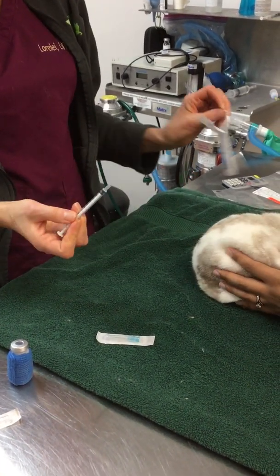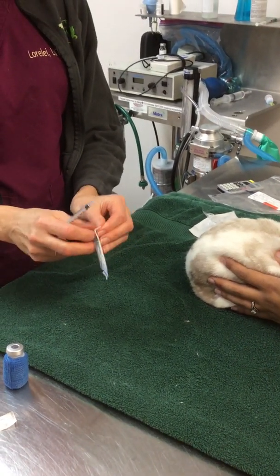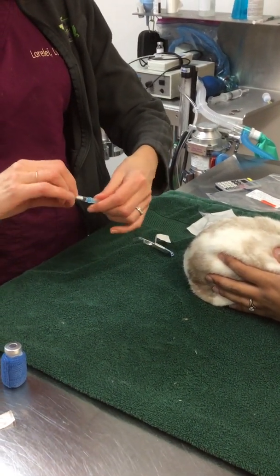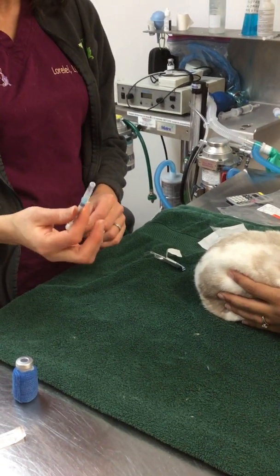These syringes open like so. The needles open like so — they are not threaded, meaning it's not a twist and turn on, it's more like a push. And the needle is now secured to the syringe.